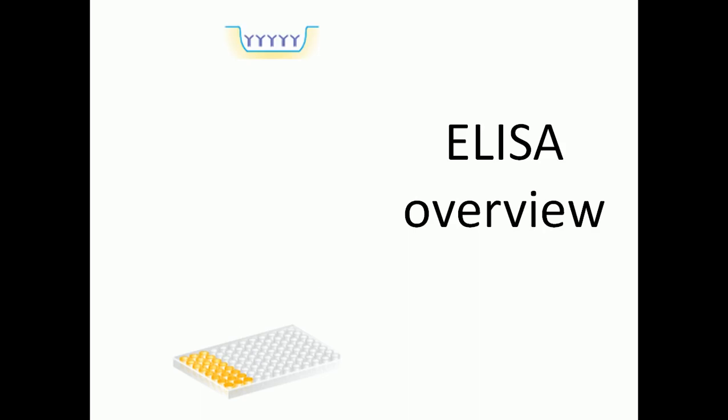If you look from the longitudinal section, you can see this. These wells are covered with a specific type of antibodies. Remember? Let's say these are the antibodies, the Y-shaped structure. They are attached to the well bottom. So at the bottom of the well, all these antibodies are attached, and their FAB portions are free to react.